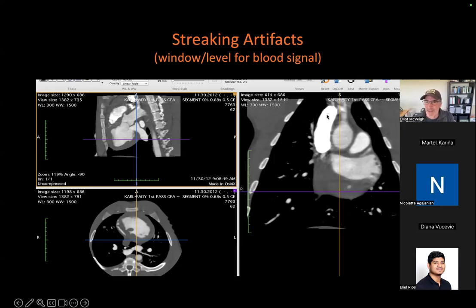look at the brightness that we see in the superior vena cava. It shows that a lot of contrast was injected into this heart. This is probably a higher contrast dose than you would do in a human. This was being done to try and image perfusion, is my guess, in an animal model. And so we have this really bright contrast here.